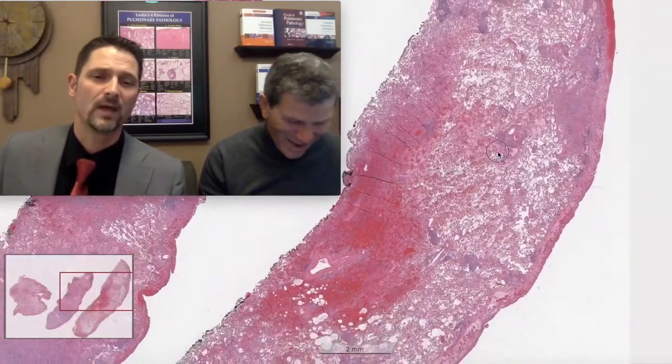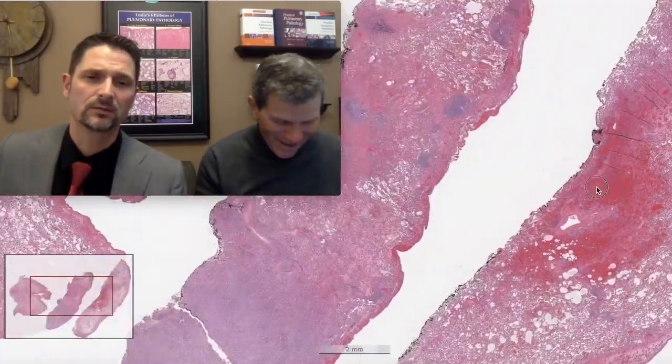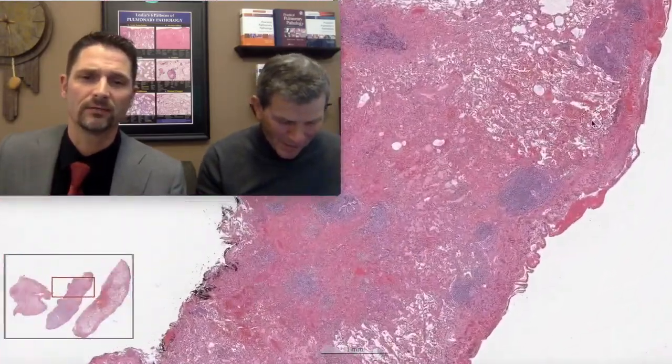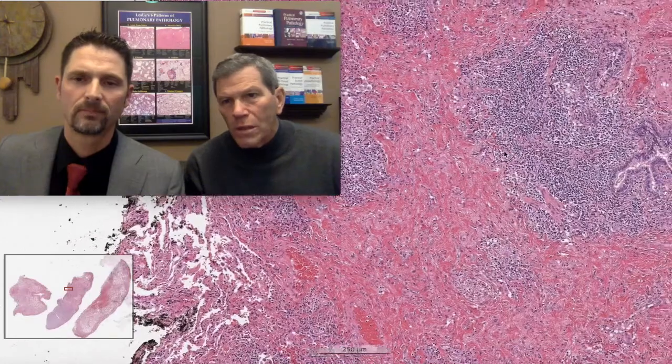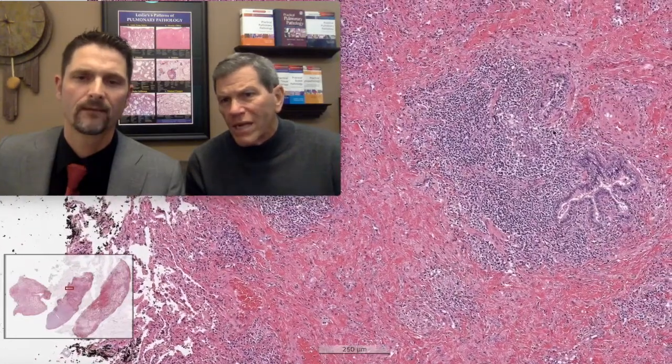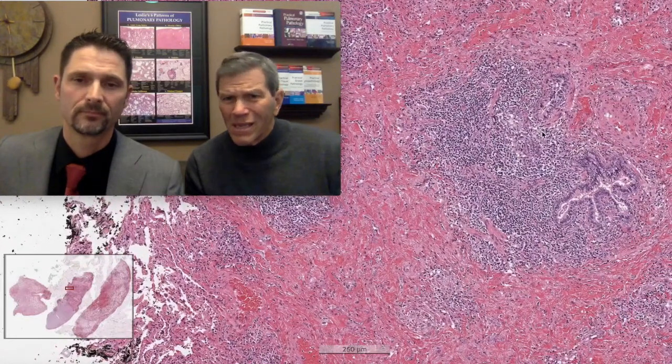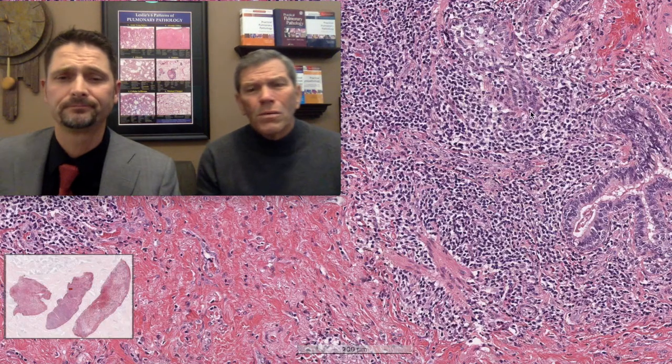Away from the nodule, what else do we have in here? We've got some smaller lymphoid aggregates next to airways — that kind of looks like a bronchiolitis, a nodular chronic bronchiolitis. No follicles though, so I don't think it's follicular bronchiolitis. That was on the list, and I'm not seeing that.